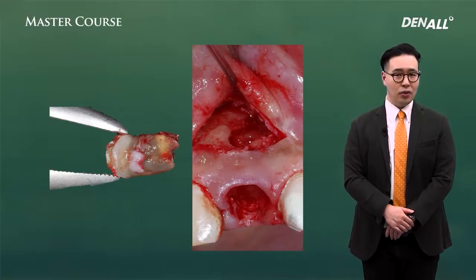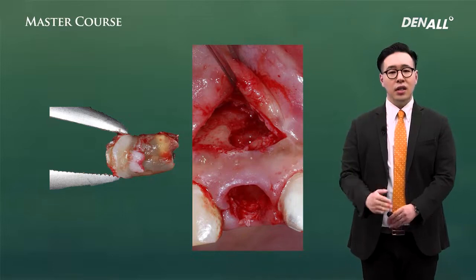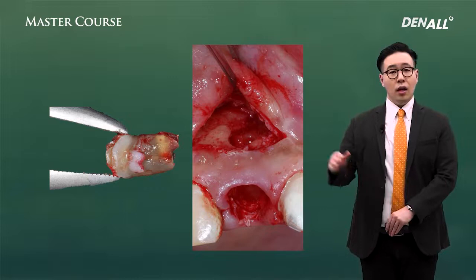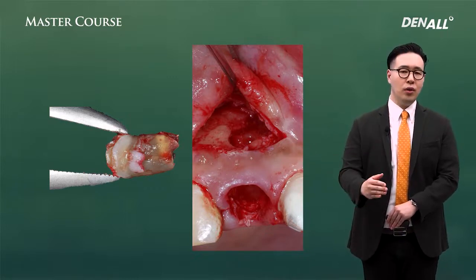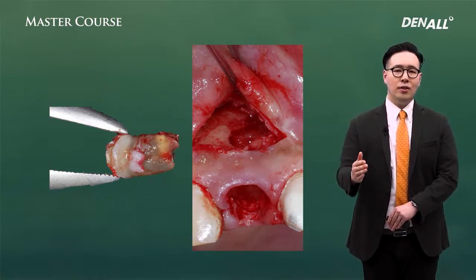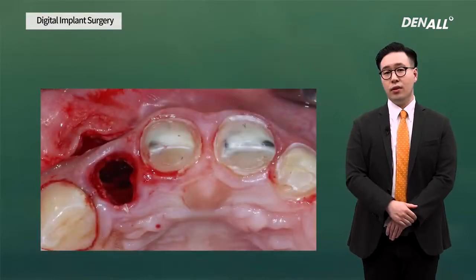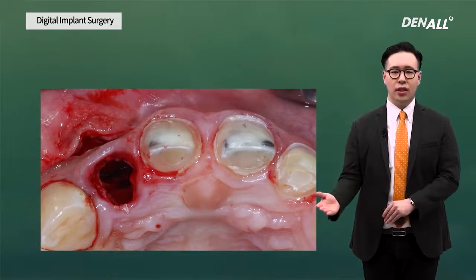In this case, if I raise a big flap from the marginal gingiva using a vertical flap, the interdental papilla and the buccal marginal gingiva, and the buccal bone tissues, which are very important critical microaesthetic structures, can be unnecessarily lost. In this patient, there is a trace of apicoectomy done in the past.